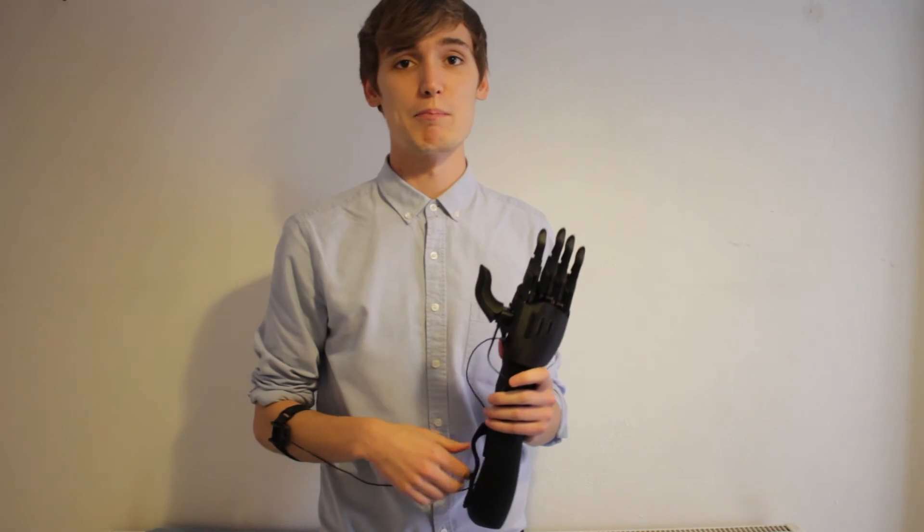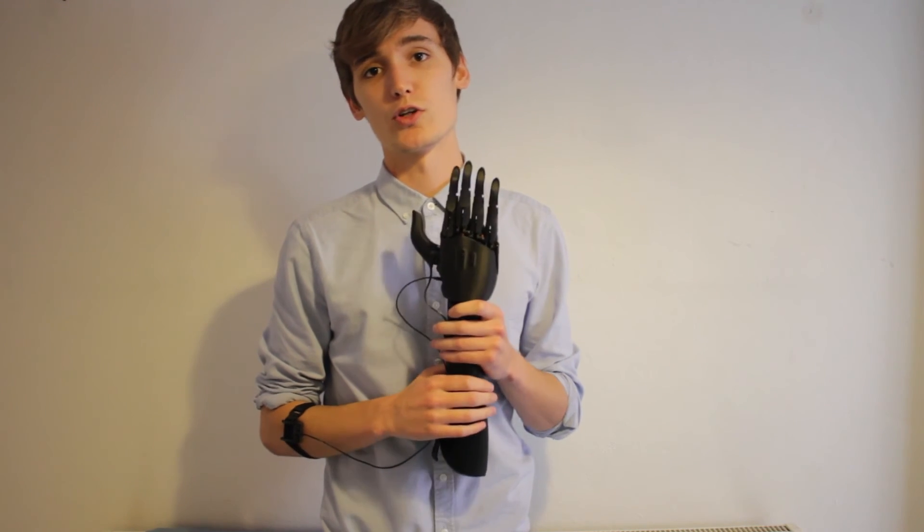As we've said, we want this to be a medical grade prosthesis. At the moment we've got a company working on creating a silicon liner from the 3D scans we got from Dimensional Engineering, and we should hear more about that in the next few days.